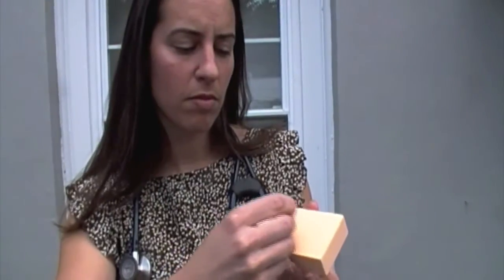What we'll do is bring your child into the office, we'll wash their cut with soap and water. Depending on your child's age, we may ask you to help us keep them still. And then while we're holding the cut together, we'll take the Dermabond just like a glue stick. We let the tip saturate. And then we paint it on in just a few brush strokes. After a few minutes, this is going to hold just the same way as a week or more worth of stitches, so that your child can get out of the office and get back to having fun.